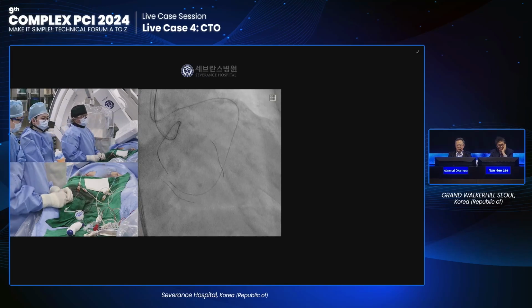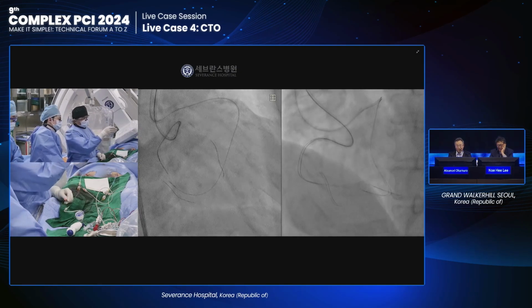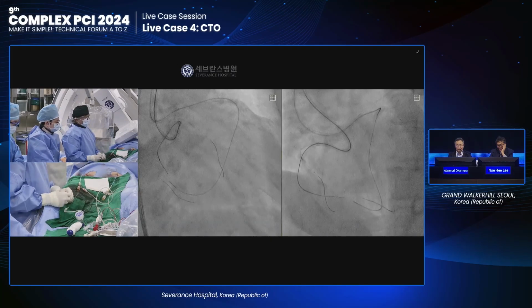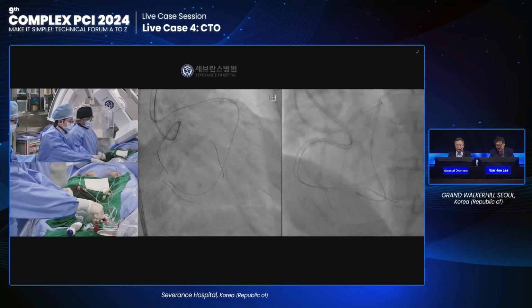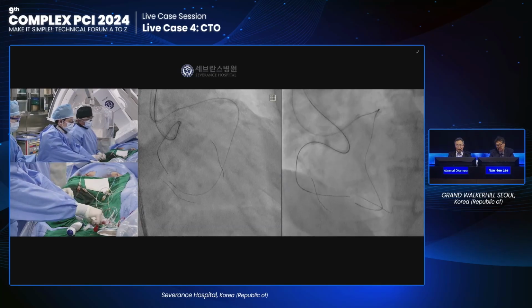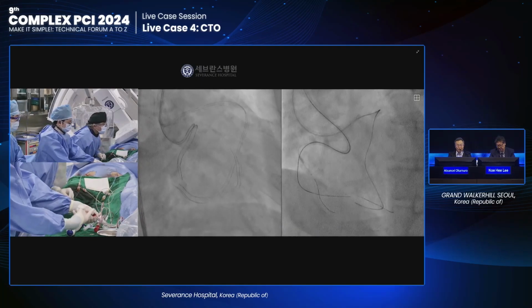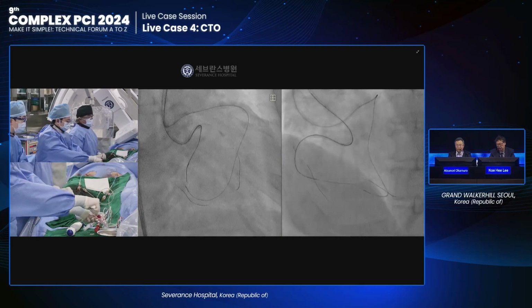Okay, so I think there is very little resistance. Before advancing through the bended portion, I felt some resistance. However, now it's okay. So maybe almost near the distal. The wire is the Gaia Next third. Dr. Okamura, Gaia Next 2.